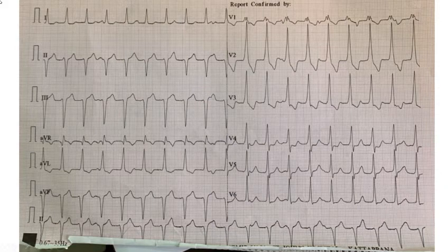You can make out that in the first one itself, you can see this is a P wave. Then there's a P wave here, and a P wave here. Here you can see a P wave, another P wave here, and another P wave here. So there is an accelerated idioventricular rhythm. What is the rate? Around about 100, yes. It's a case of accelerated idioventricular rhythm, and you can see that the P waves are independent. Another possibility that we can think about is? Left posterior fascicular tachycardia can be there, sir. Okay, you can think of a fascicular ventricular tachycardia where the rate can be higher. The rate is actually 110.